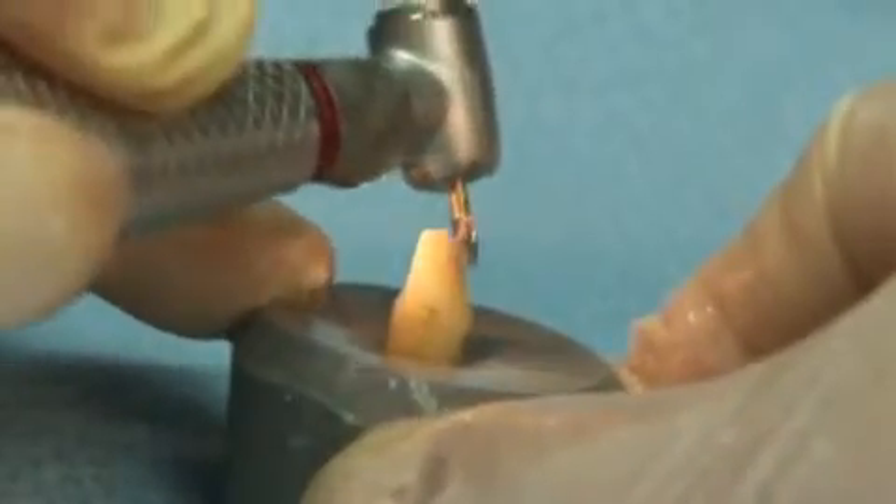Great White Ultra has a shape and size ready to meet all of your crown preparation needs.